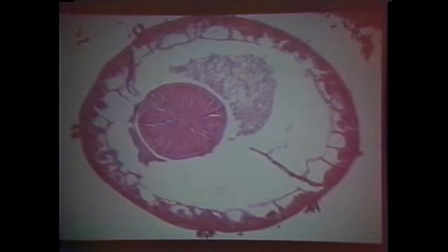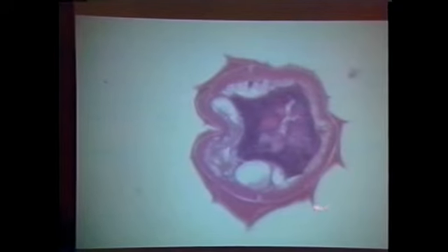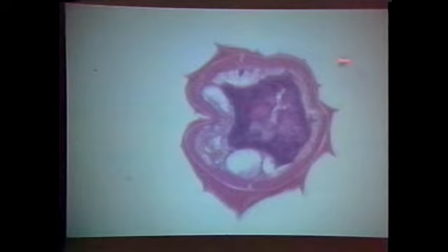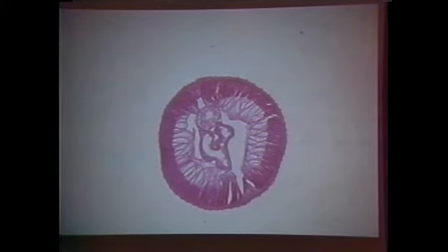Here's a cuticle. It's thick, and then it comes out to a point. And you will have to remember if this is a cross-section of the worm or the longitudinal section of the worm so you can get a feeling for just what this cuticle structure is. Sometimes they're small little bumps. Sometimes they kind of come out like ears. Sometimes they're different sizes, and they differ in the space between them. Now let's talk about external ridges. Some worms, this is a cross-section, people. How do I know?